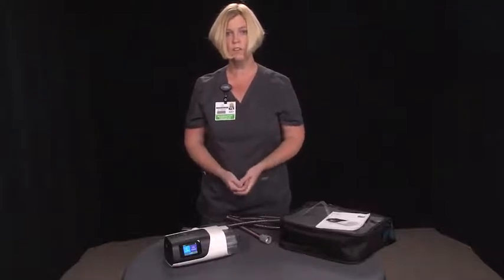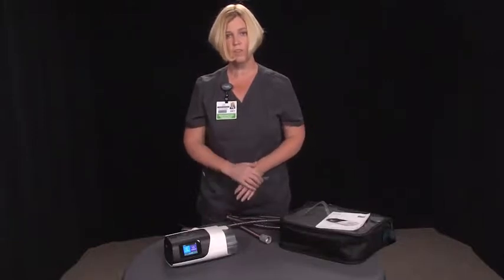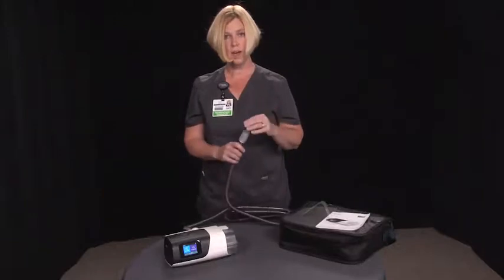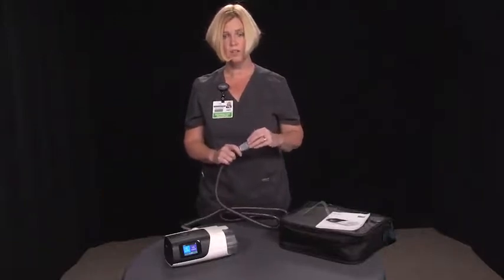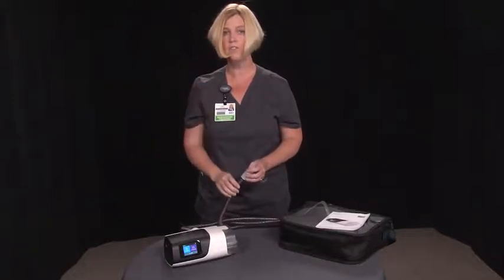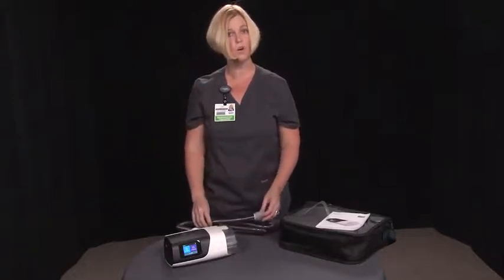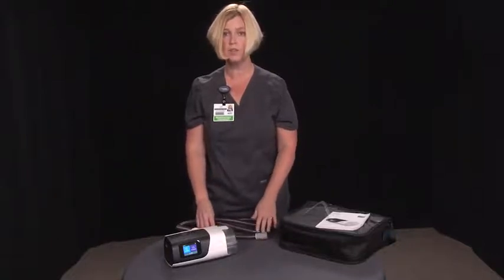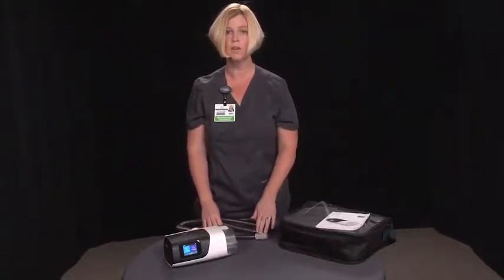When you are ready to use your machine for the night, you're simply going to fill up the distilled water chamber. You're going to attach your mask to the end of the tubing. You'll place your mask on your head. There are a variety of different masks, so I can't show all of those here, but you and your doctor and your respiratory therapist will help you choose the one that is right for you.